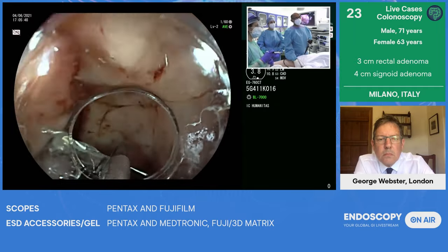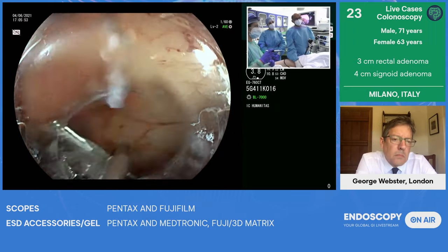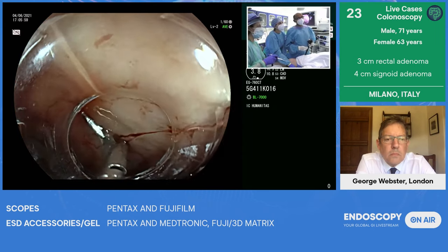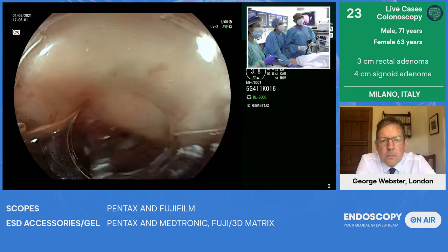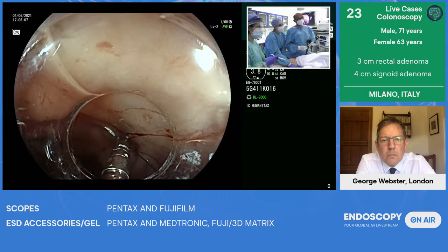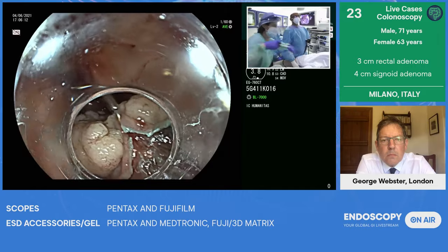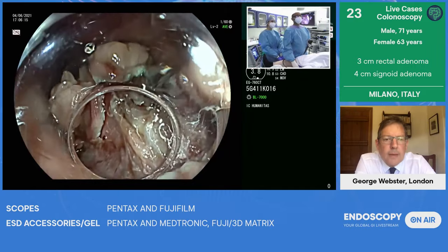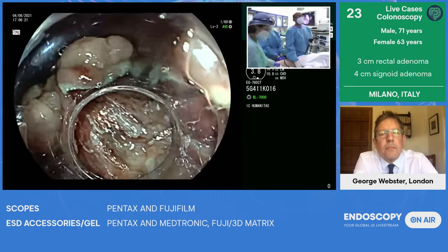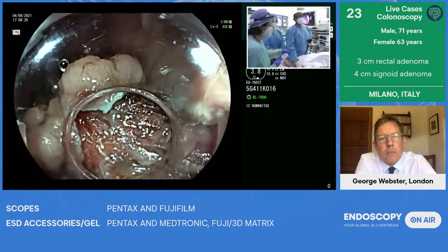So generally, you put it on the anal side and clip the wire to the cecal side, so it should open the plane. So if you could hold the scope for me there, please. I think I can feel the traction there. So if I clip it there, open, please, and close. Okay, and fire. Yeah. Okay. So now you see, George, this has opened up the submucosal plane. I get the knife, please. Knife. And we'll dissect in this plane.